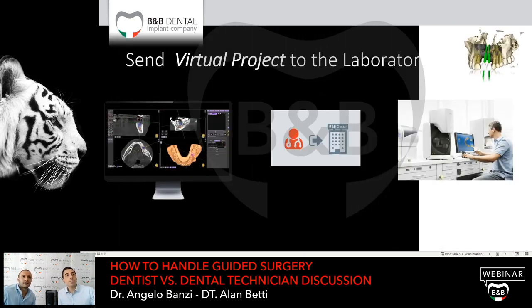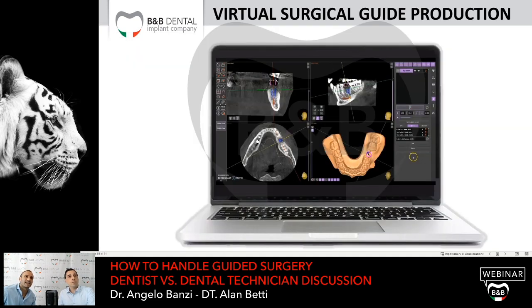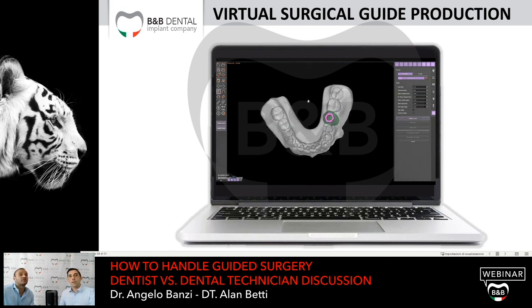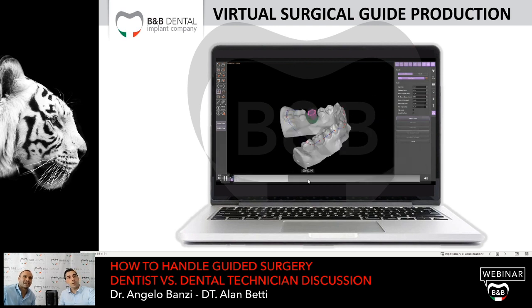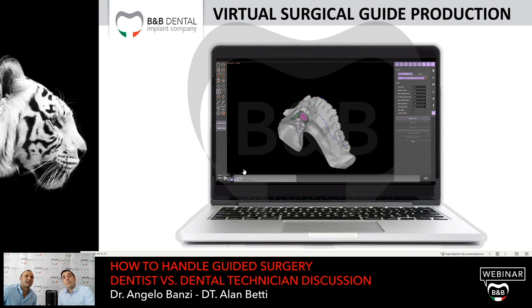Now that the matching is done, the case is sent to the dentist, and the dentist is going to decide the implant positioning. As I mentioned before, I didn't ask for a real workup at the beginning, but I asked for a virtual workup. So what Alan is going to do is to create an image.